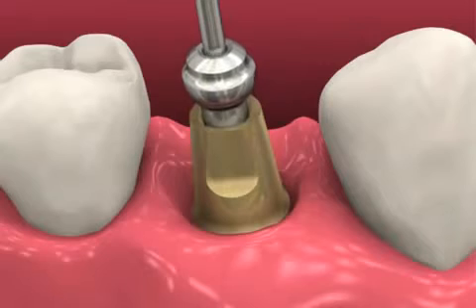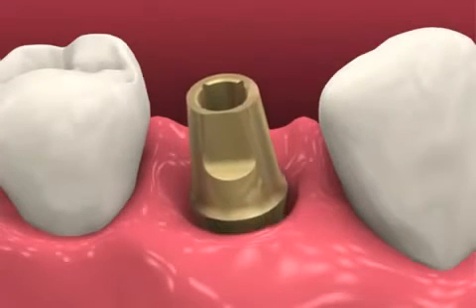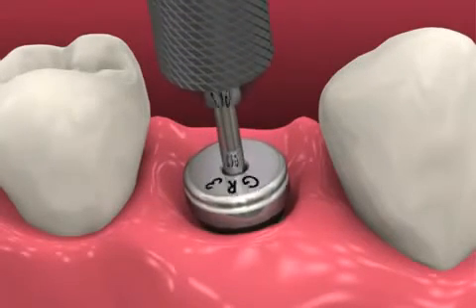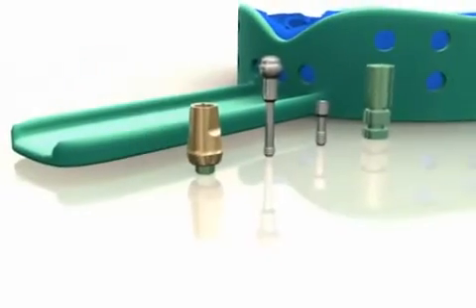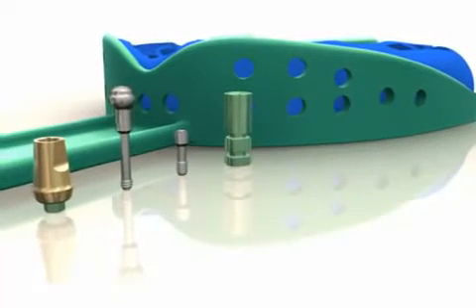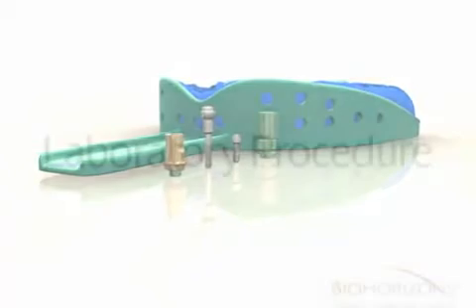Unthread the ball top screw, remove the 3-in-1 abutment, and replace the healing abutment. If desired, a provisional prosthesis may be fabricated using a PEEK plastic temporary abutment. Send the abutment, ball top screw, abutment screw analog, and impression, as well as a bite registration, shade, and opposing model, to the dental laboratory.